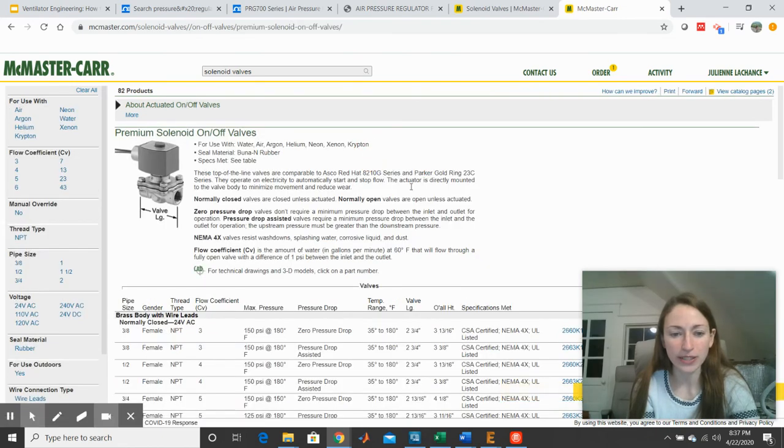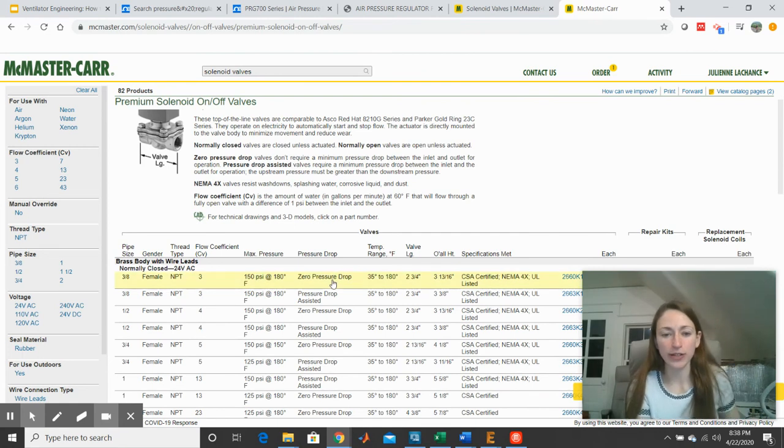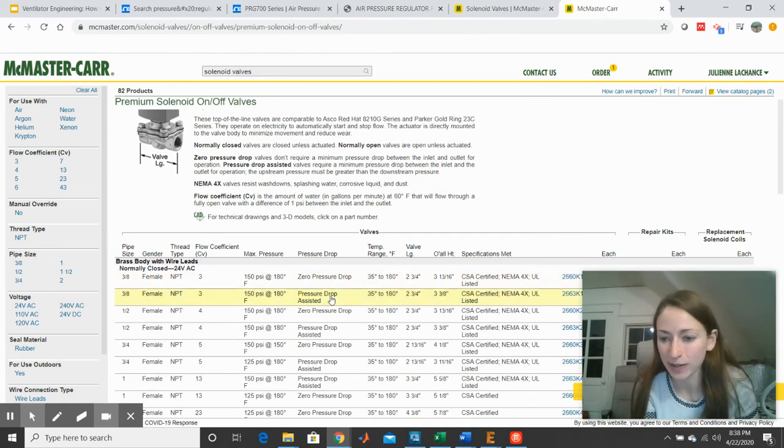And if I look at one of these, one of the things I want to be mindful of is whether or not they are pressure drop assisted. So if I were going to put this type of valve on my expiratory side, we know that we're operating at a very small pressure drop, right? So we may not get enough pressure to even actuate this valve at all. It may not open if we have it on the expiratory end. So I want to be very careful about choosing a device that requires zero pressure drop.